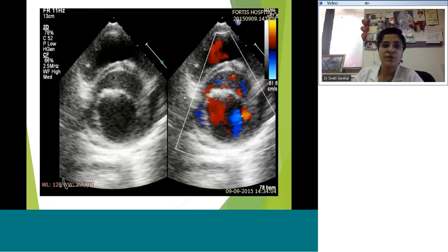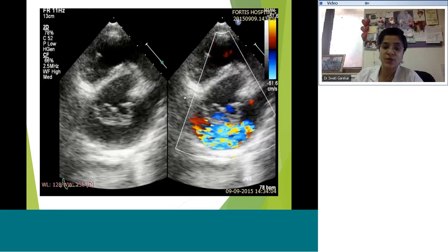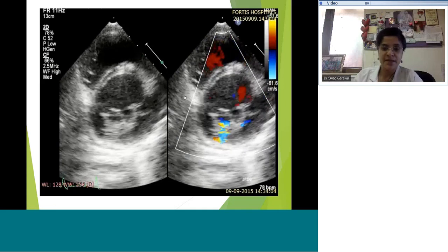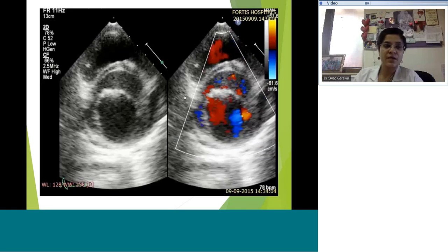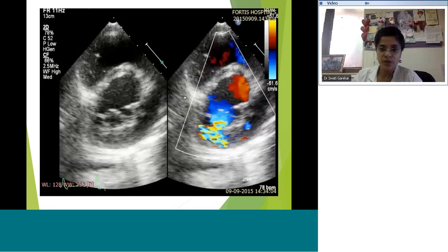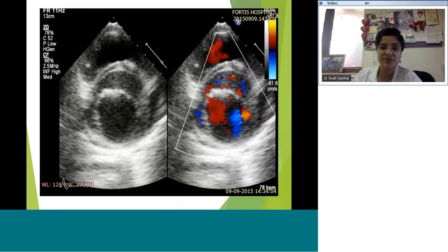So color flow, remember to assess it around 60 to 70 centimeters per second Nyquist. If you go above and set it at 100, I mean the scale, then you run a risk of losing the yellow and under quantitating your MR. So very important, especially when you're trying to eyeball it and determine that you have your Nyquist set right.